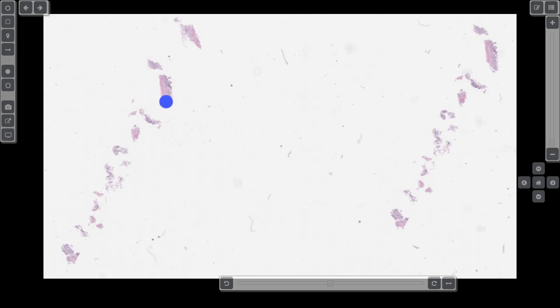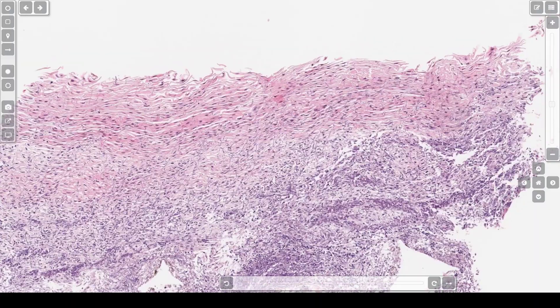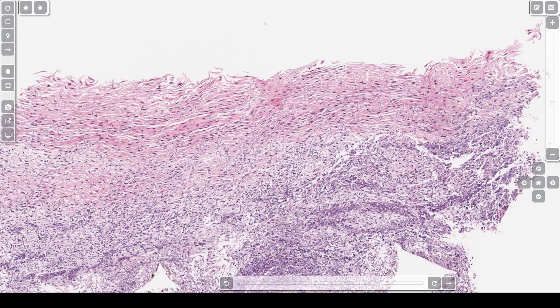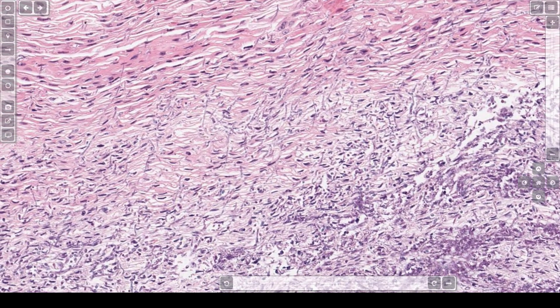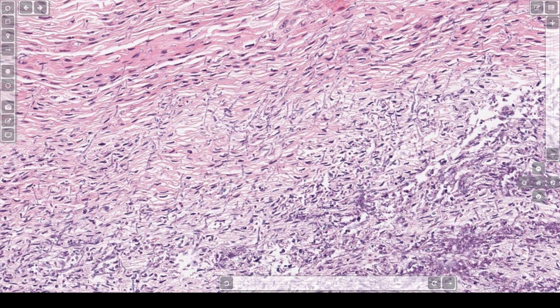This is case 7: candidal esophagitis. Taking a closer look at this piece, at this power you can see there is squamous epithelium. In addition, there are very faint blue hyphae — these are candidal hyphae. You can see them better at higher power. I have a silver stain on the summary slide which also shows them better. This is candidal esophagitis.